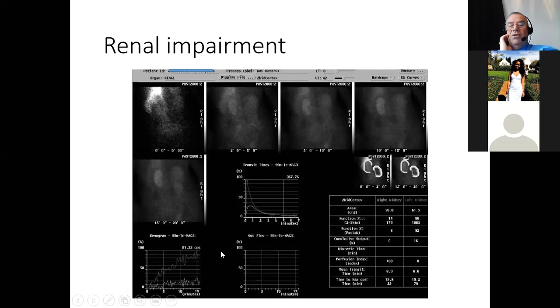That's because both of these kidneys, again, are not really working. Now, when these kidneys are working that poorly, it's difficult to tell whether it's due to obstruction or another renal disease. The divided functions, again, probably don't matter so much because you're not going to get a good uptake curve with this kind of interference. So probably the best thing you can say is both kidneys aren't working very well. The left kidney is working slightly better than the right kidney.